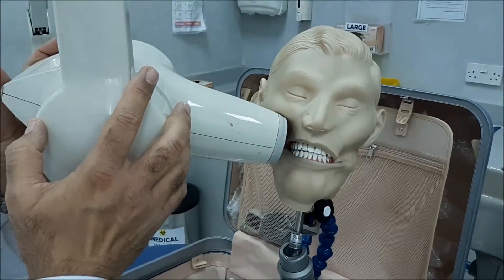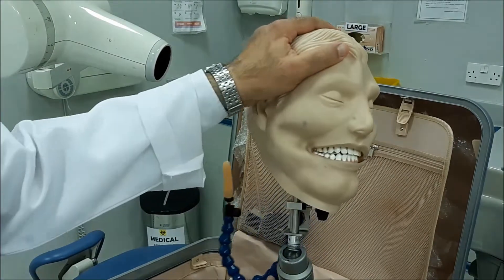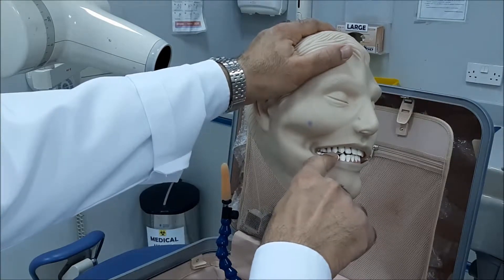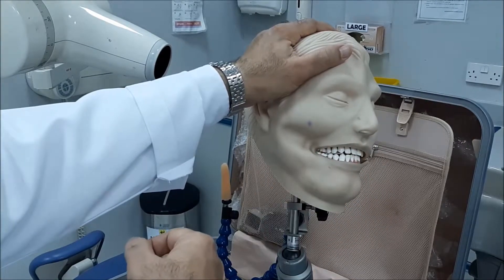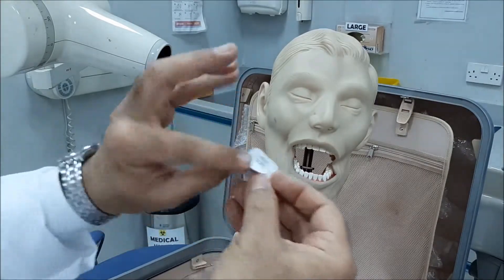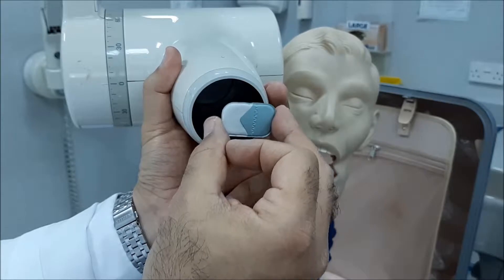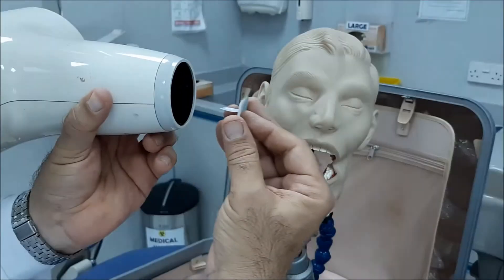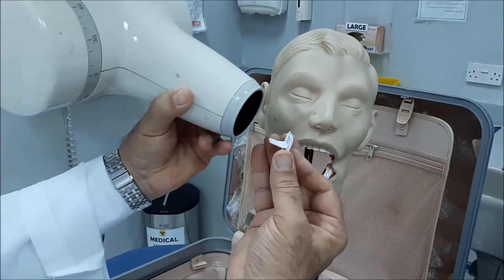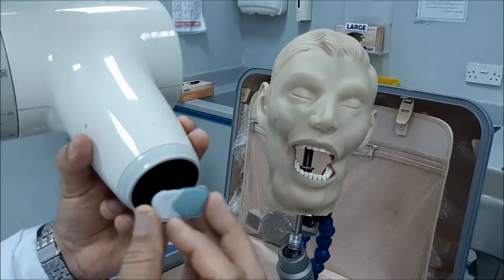The last thing to take care of is complete coverage. Since nothing of the film is visible except the bitewing tab slightly extending between the teeth, you need to make sure this tab is centered in the cone. If it goes to either direction, the film will not be fully covered. To summarize: vertical angulation is plus 10 to compensate for film tilting, horizontal angulation must be perpendicular to the buccal surface of the teeth.